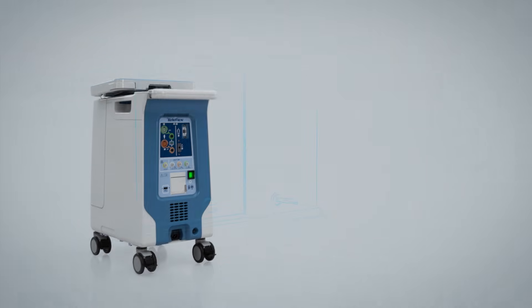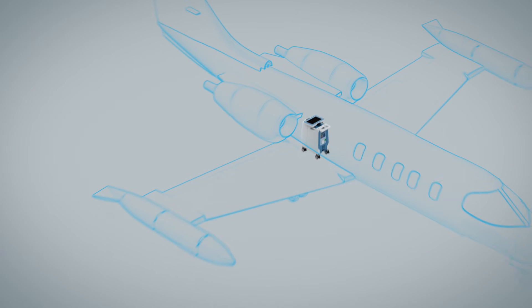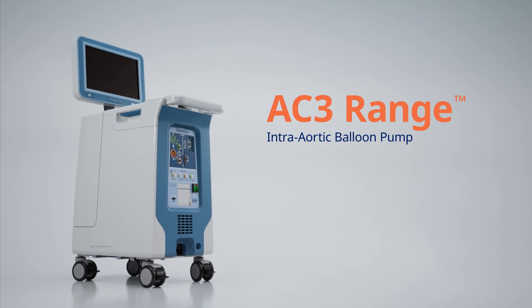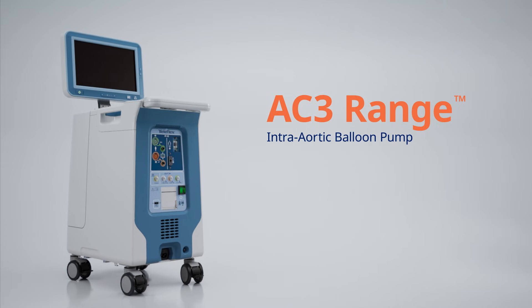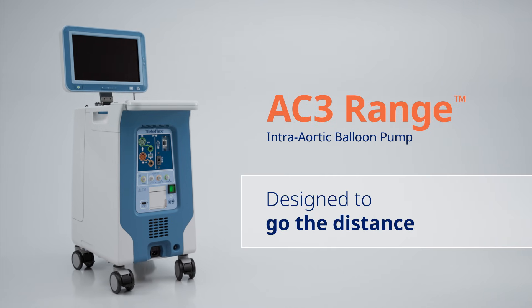Designed to accommodate various transport configurations, including ambulances, fixed-wing, and rotary-wing aircraft. The AC3 Range Intra-Aortic Balloon Pump from Teleflex — providing stable, reliable IABP therapy wherever patient care takes you. Designed to go the distance.